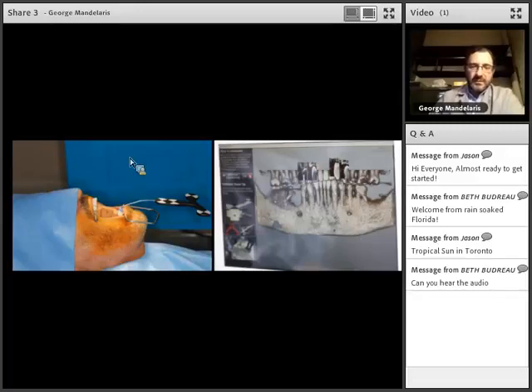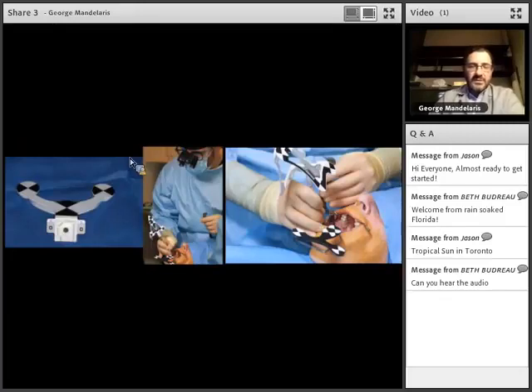There's the jaw tag in place. And now I'm using the tracer tool. I've selected my 4 reference points, and now I'm going to trace those out. So we use the jaw tracker here, the jaw tag, as you see there on the left-hand side. The calibrator that we were using earlier has been updated to this model here, so I'm registering that. I'm tracing, as you can see, which is essentially a contact map. We're contact mapping 4 points and 100 points per tooth.